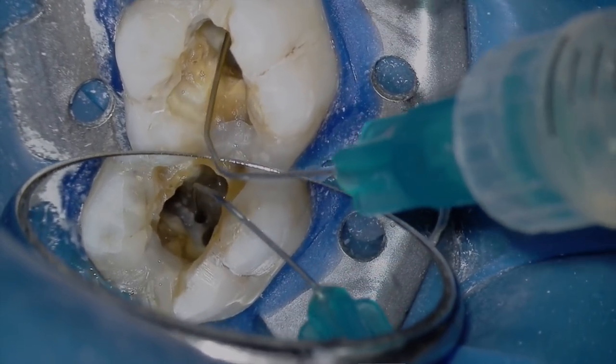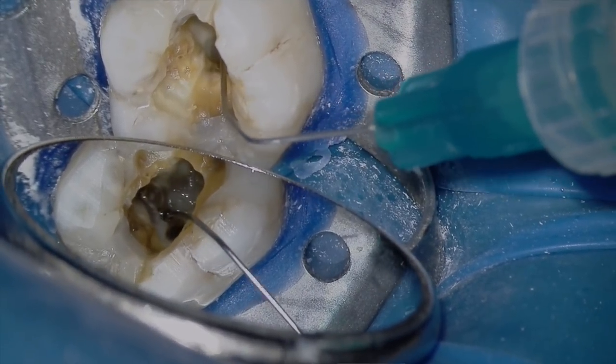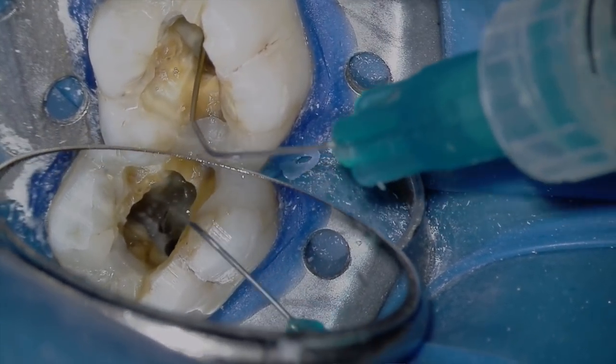You know when you're at the top of the mountain — that's when you take your final root canal x-ray and you're just like, yes, that looks awesome, I am feeling great. But you know when either the files aren't going to length, or the final x-ray shows something short and you think, oh my gosh, I don't know what to do. I'm short on time, I'm stressed — the SLOB rule can come in really helpful to figure out which canal is which.